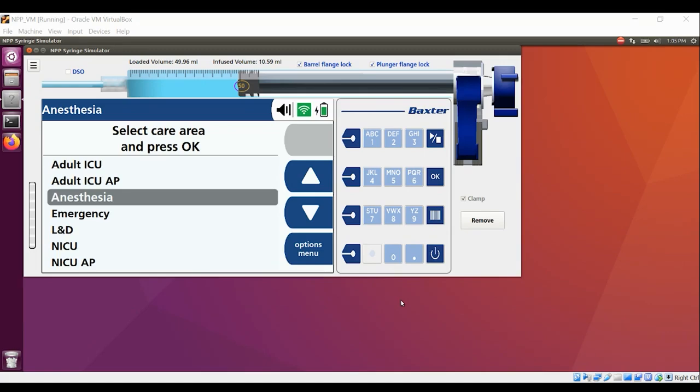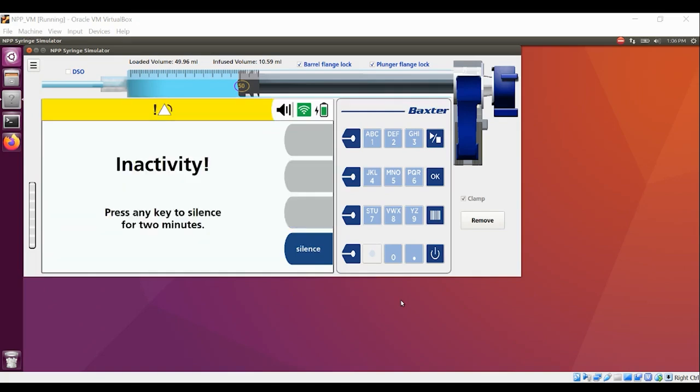They want very accurate infusions at very low rates. And they want to be sure that they can concentrate their medications so that they're not infusing a ton of fluid to the patient. They want to be able to bolus and load. So our pump can do both of those features.